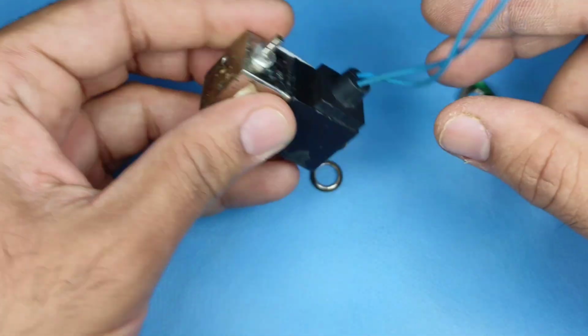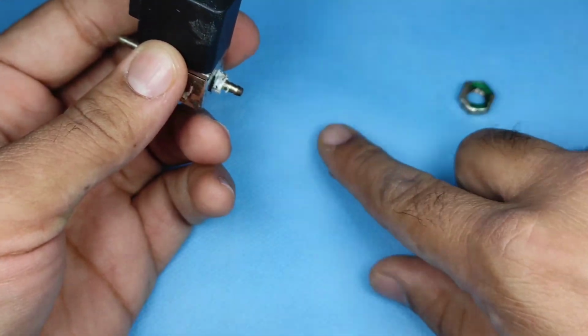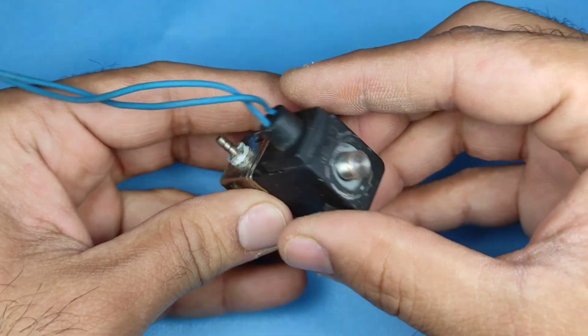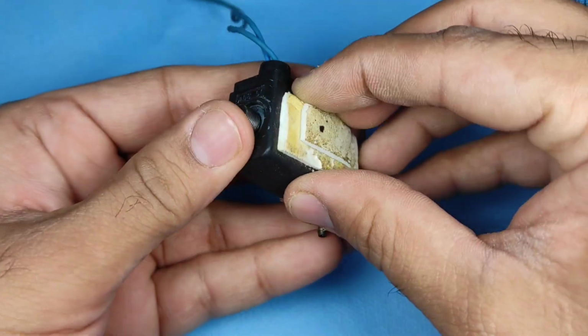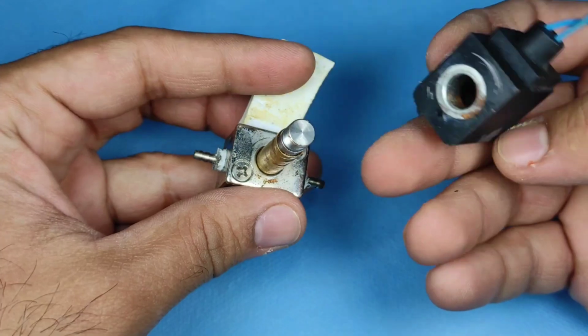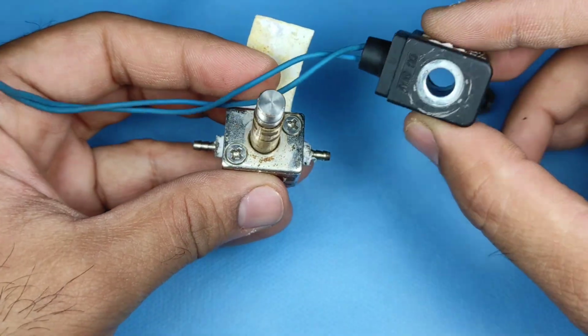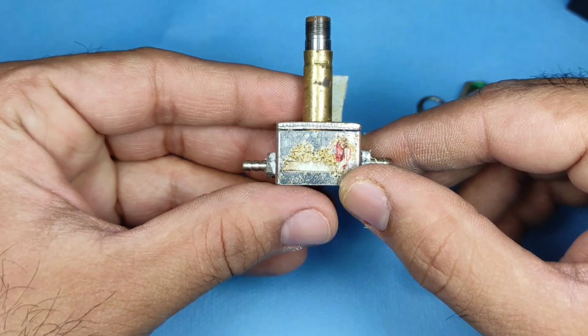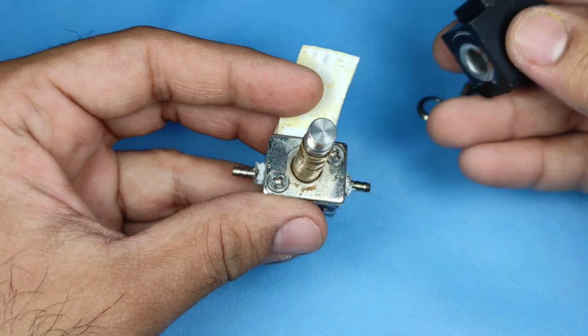As you can see, I opened up the topmost screw and there is a small visor to connect it. Now I'm going to separate this. There is a two-way tape at the back to keep it attached to the base of my tray. That's all, no major significance. So this is the electrical component which is out. Now here is our main piston, our brass component.